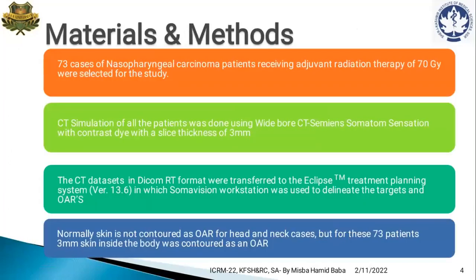Materials and methods. 73 cases of nasopharyngeal carcinoma patients receiving adjuvant radiotherapy of 70 gray were selected for this study. CT simulation of all the patients was done using wide bore CTs from Siemens known as Somatom Sensation with contrast dye, and a slice thickness of 3 mm was selected.